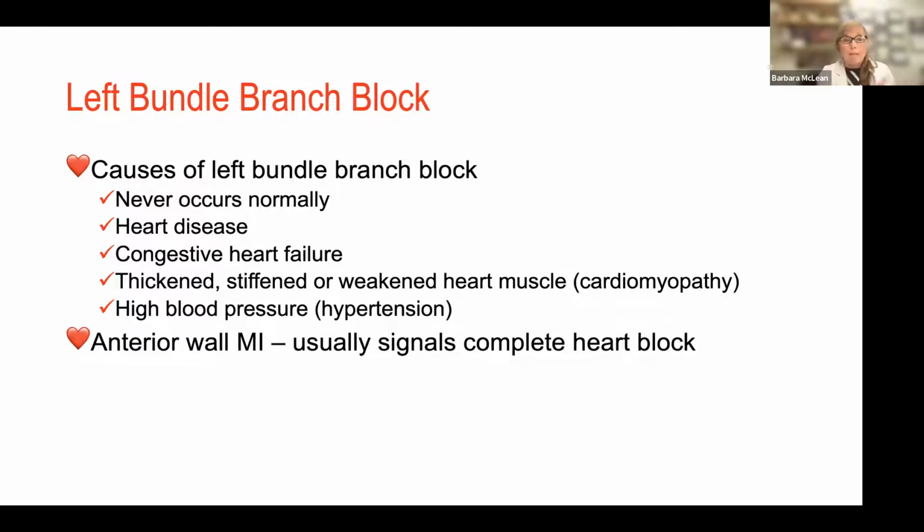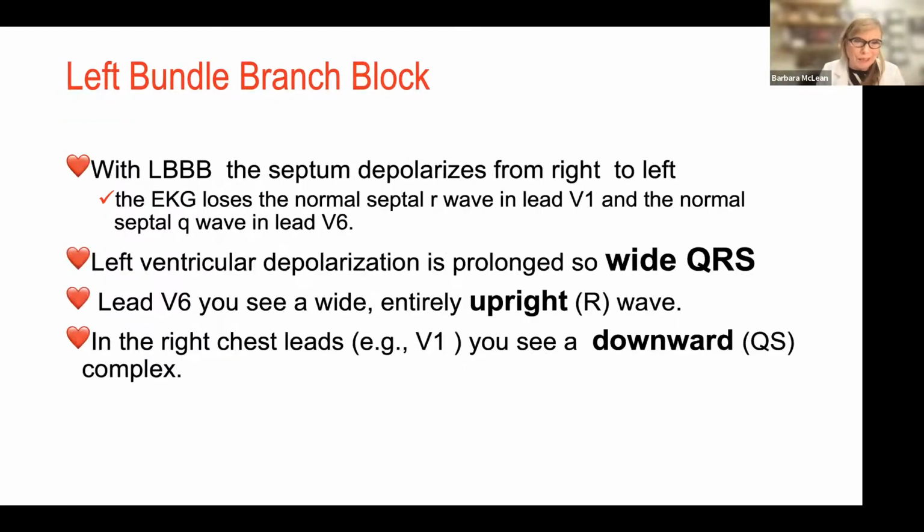He had a left bundle branch block as a first-degree AV block, but now he has a supraventricular dysrhythmia. Now he's got a right bundle branch block in addition because his rate is so rapid, and now he's in complete heart block. And patients who go into complete heart block for this condition, by the way, epi and atropine ain't going to work for them. You can do CPR, and you've got to get a pacemaker on board, and that needs to be quickly. Now, pacemakers have kind of fallen out of favor in our ACLS guidelines. That's because nobody wants you to pace a patient that doesn't need it. This patient's going to need it, though.